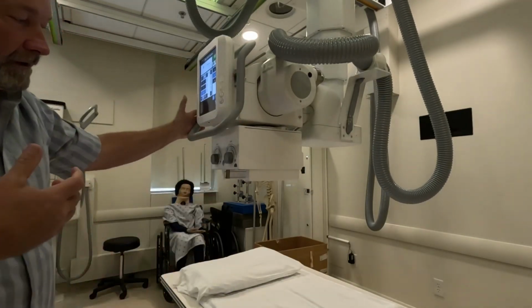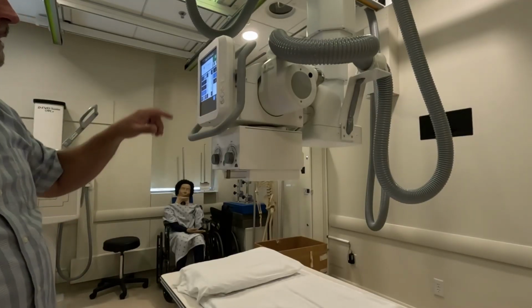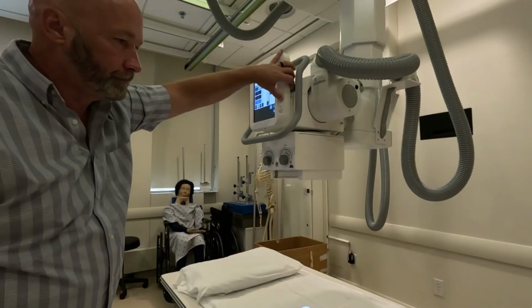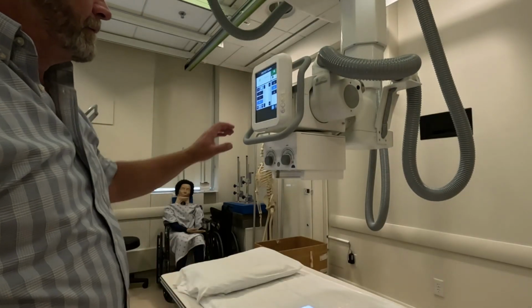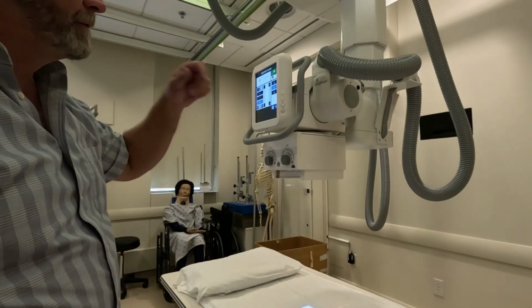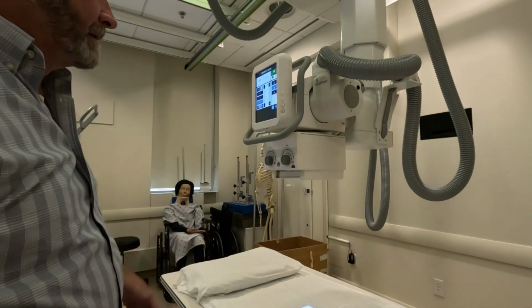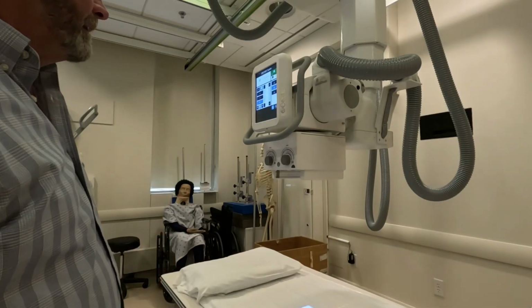You want to make sure, if you're using a system like this, you don't use this button or the everywhere button, but rather use the orange button, and you'll hear it before it locks in, and then it stops itself. So what you don't want to do is you don't want to use that or that. That's number one. And number two, you don't want to push too hard and too fast, or you may override your detent. Be gentle with your machine. It's very expensive, the x-ray tube. The entire imaging system is very expensive, so be gentle with it.